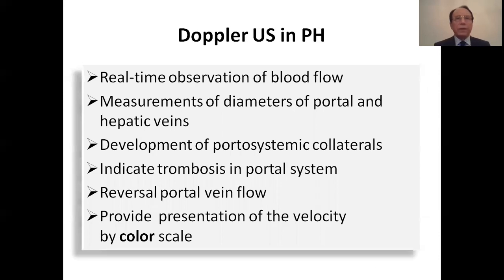Recent developments in digital technology have introduced various imaging modes: color and power Doppler, harmonic imaging for contrast enhancement, three-dimensional visualization, and fusion imaging. Doppler ultrasound, with the advantage of real-time observation of blood flow, evaluates the severity of liver disease and portal hypertension.